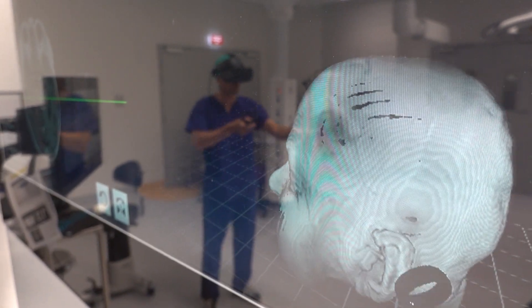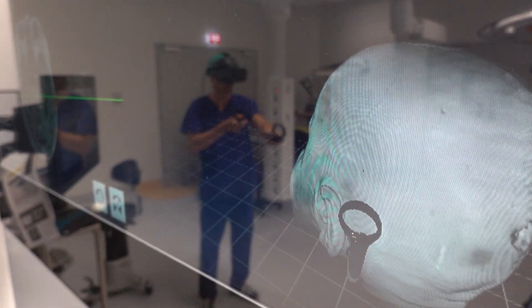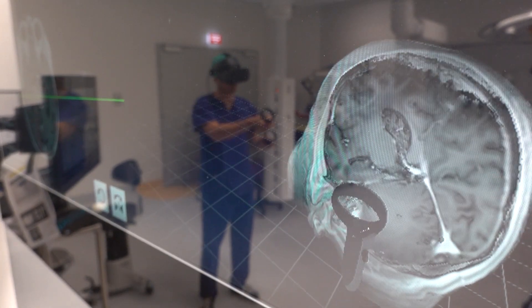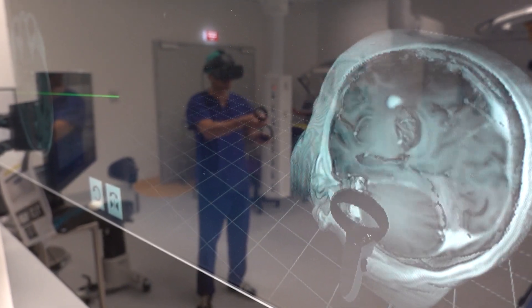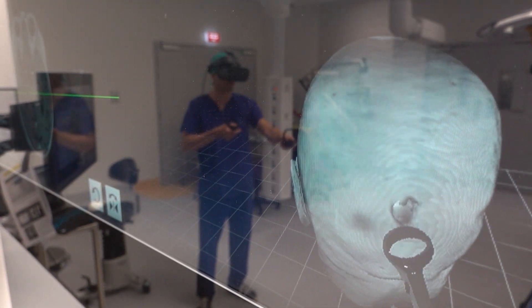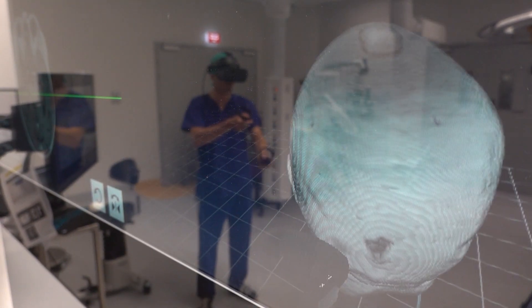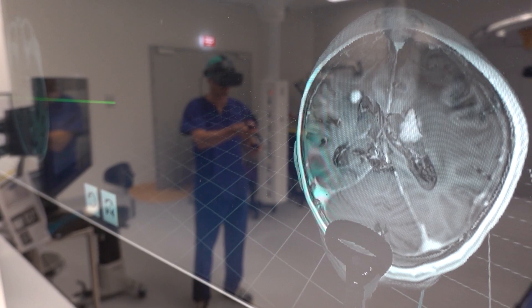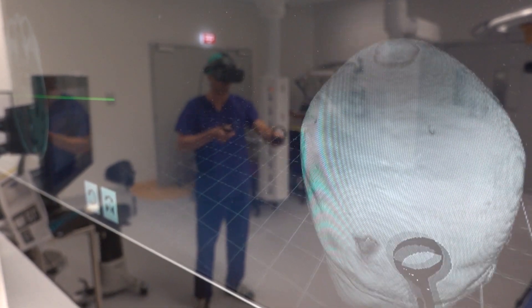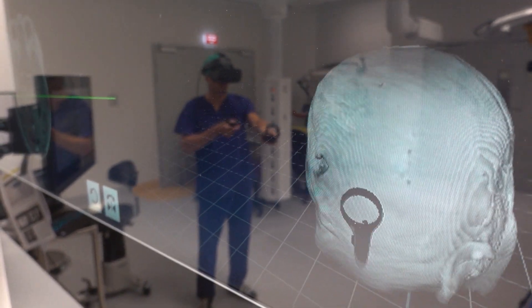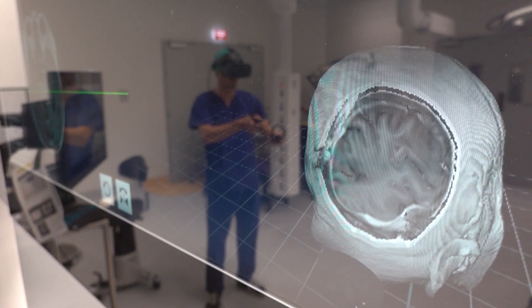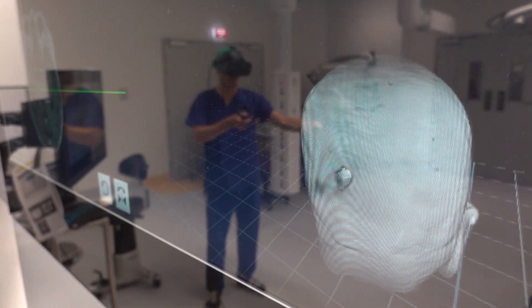In this case the lesions are placed not far away from the ventricles, and I can really have a look at the anatomy in all the different planes to be able to target my biopsy needle or my surgical approach in order to avoid the vessels, the sulci, or the ventricles.